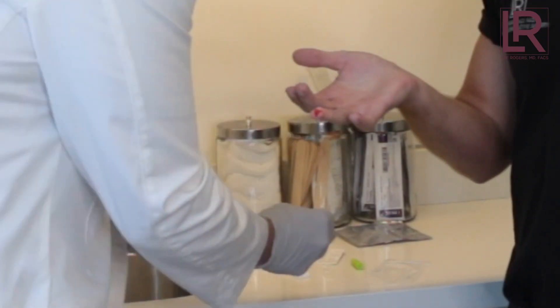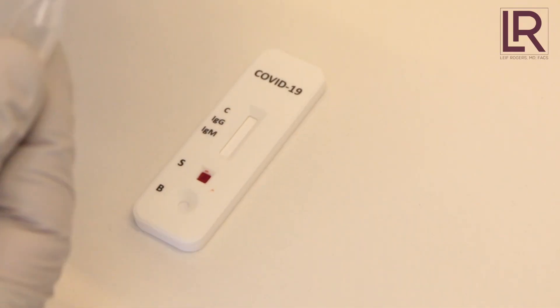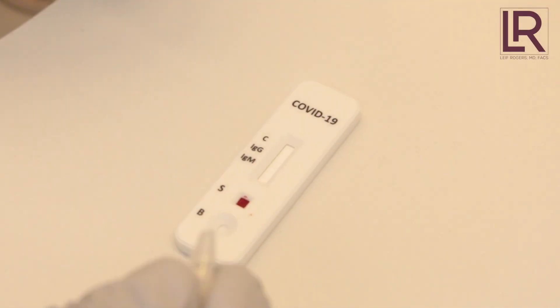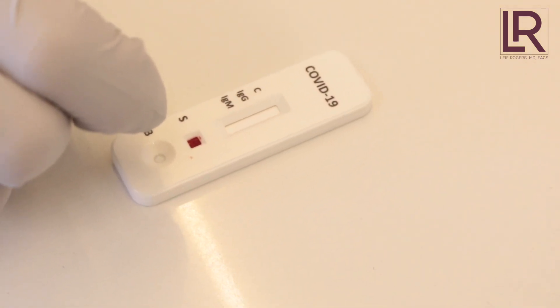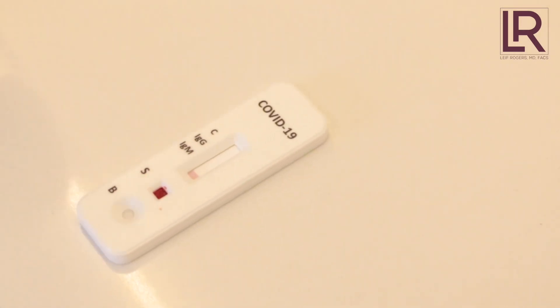Okay, so this is the buffer. You pull off the end and put two drops on it — one, two. Then after a few moments it starts creeping up the strip.